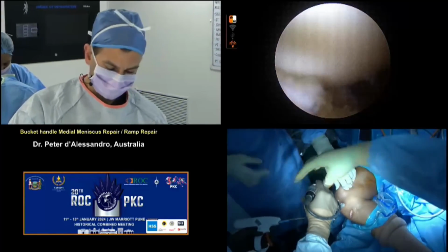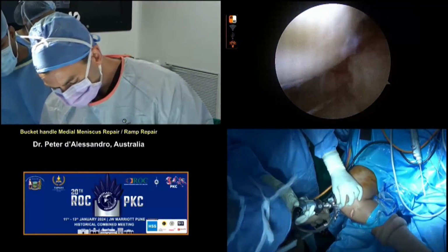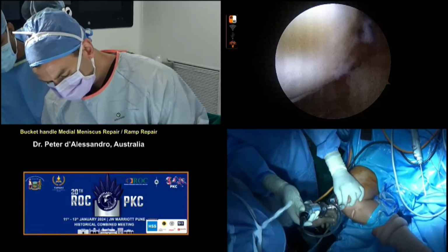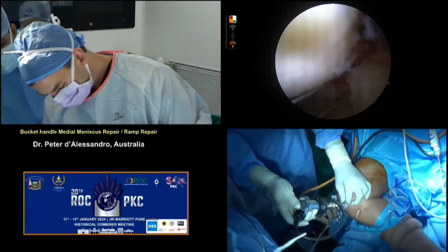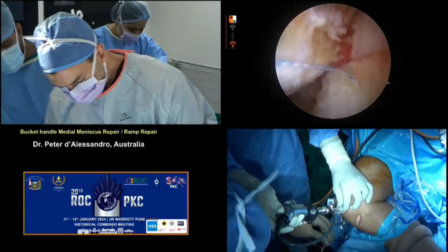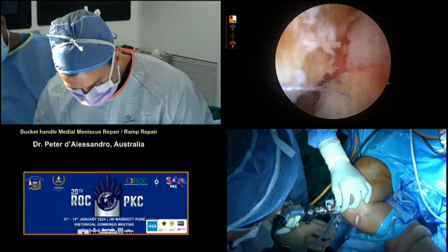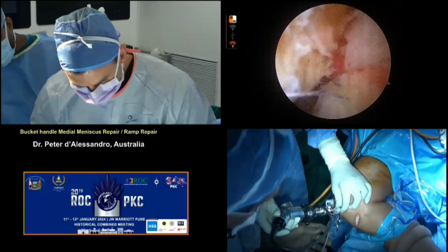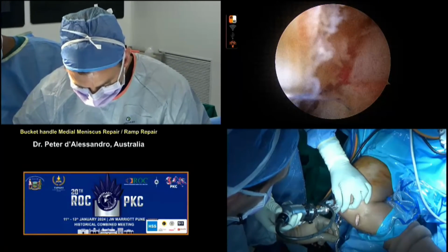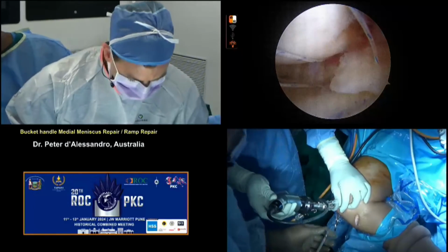That looks great, as long as it stays great, but so far I feel like we're doing okay. What if the tissue quality is not good on the medial side? So what is your bailout situation in such cases for the radial tears? This medial fragment, if the tissue quality is not good, there are chances of cut through. So what is your bailout situation? Bailout on the medial side, then I'll go to inside out. And then do as many PDS as we can.